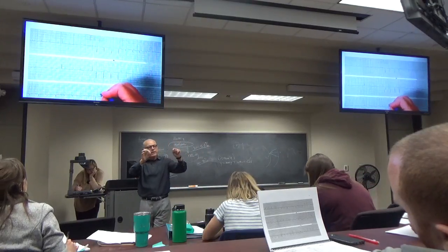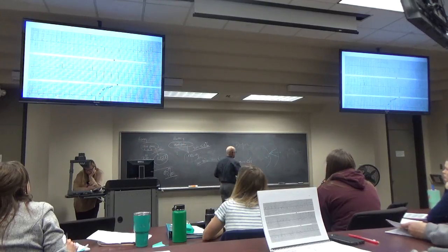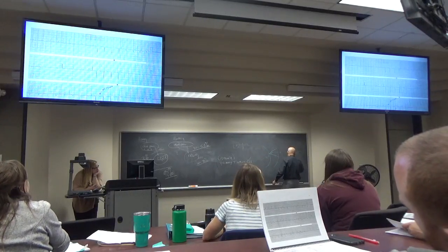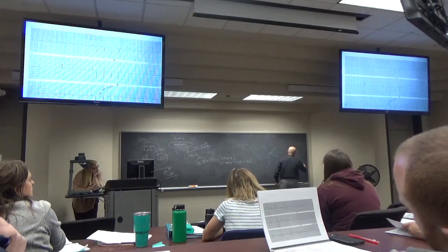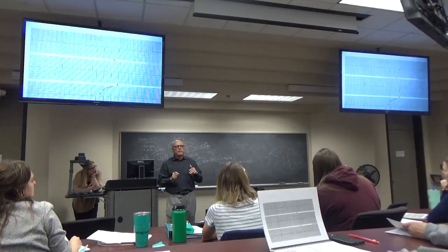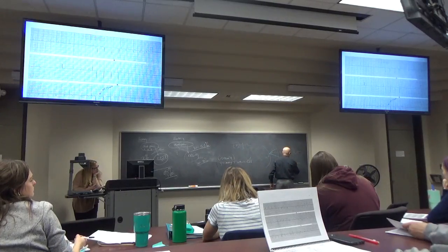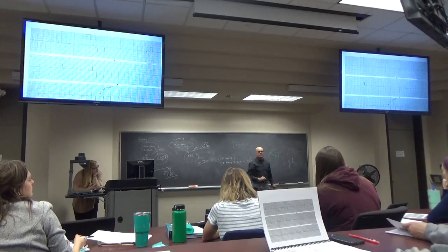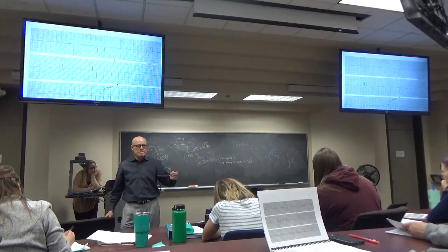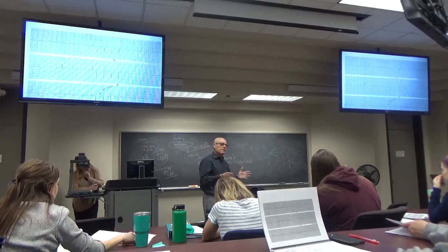This is the way I think of it. First thing that happens when you tie a ligature around the rabbit's coronary artery is the T wave flips. If you leave that ligature on long enough, it's as if you tied a string onto this ST segment, pulled it up, and drew that picture. That's injury pattern. If there's a Q wave with it, it's an infarct. That makes sense? It's a time progression. And so, yeah, that's probably a T wave.